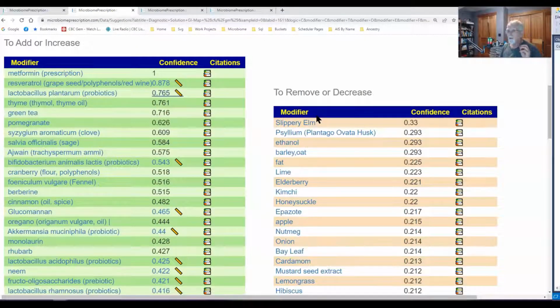Avoid trying to do homeopathic things. Say, oh, I'm taking some Lactobacillus plantarum. It's in my mixed probiotics. And you go in, you find it's 1 million colony forming units, 1 million, and the studies are suggesting it should be 10 billion. 1 million to 10 billion, no wonder it doesn't have an effect. So, pay attention to the rules here.